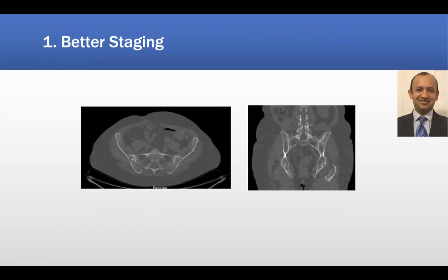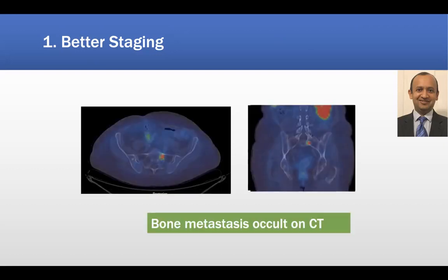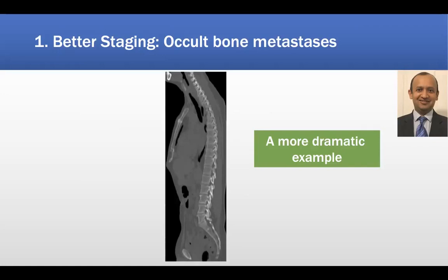So this is an example of one of our patients that we used gallium dotatate PET-CT on, and you can see that this patient has a solitary bone metastasis that was not identified on other imaging, is occult on CT, but is intensely avid on the gallium dotatate PET-CT, which changes this patient's management. Another example is a patient with multifocal bone metastases that are occult on CT, and you can see intensely avid on gallium dotatate PET-CT. The reason that they are occult on CT is a lot of these metastases can be bone marrow based and thus missed on cross-sectional imaging, as they don't elicit a CT reaction in the early stages of the metastases.